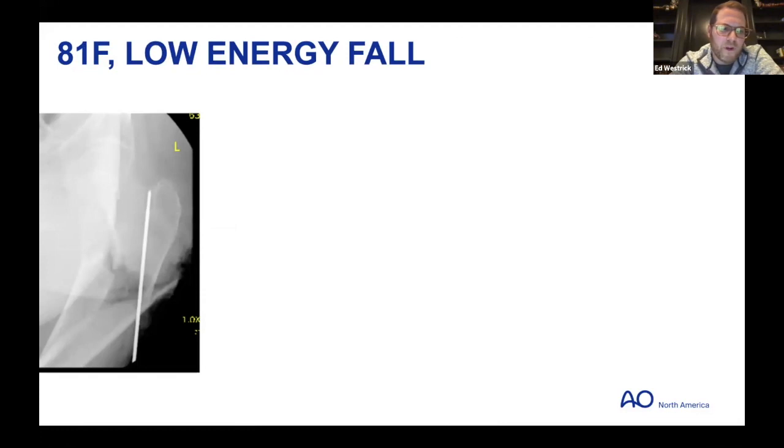So I'm pretty confident that all three of us could get a piriformis fossa start point here. But then once that was done, realigning the proximal segment to the shaft was going to be more of the challenge. So the patient was asleep, and we apply traction and use fluoroscopy and do the normal closed reduction things. And when we determined after a minute of fiddling that that wasn't going to have the success level that we wanted, for me, I'm fairly quick to open.